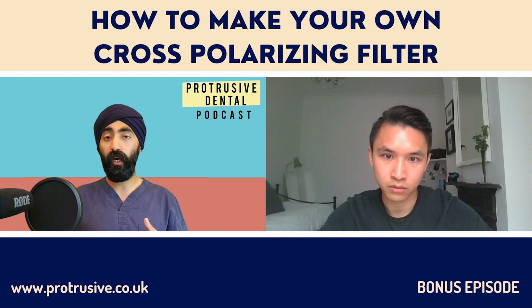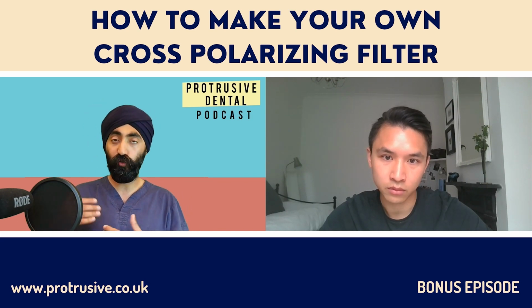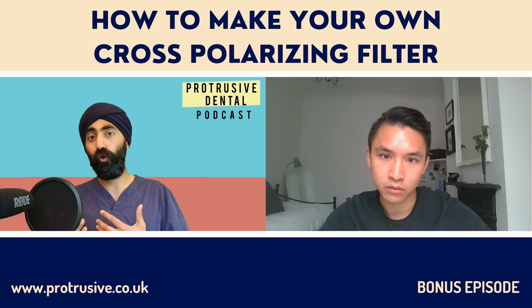The other time is white spots, Darren. So people with white spots, I tend to use whitening, Icon, that kind of stuff for minimally invasive treatment, and it helps you to almost observe the depth of the opacity a lot more using the cross-polarizing filter.